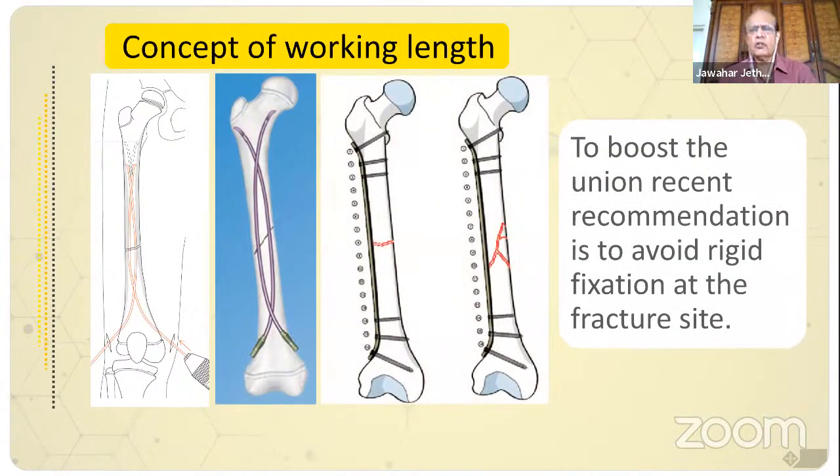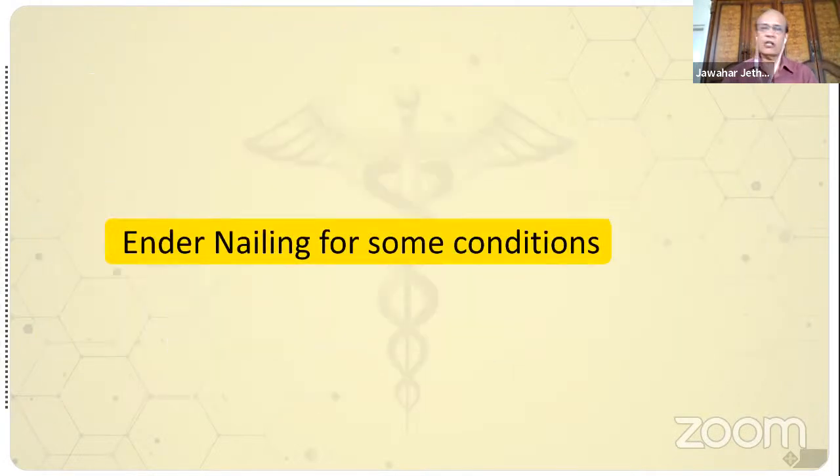This is a simple thought which is in my mind, that on one side we are talking about maximum fixation at the fracture site. On the other side, we say that to boost union, we must avoid rigid fixation near the fracture site. So both of these things are probably, particularly in an older pediatric age, like more than 10 years or 12 years or 14 years, something you can think of.